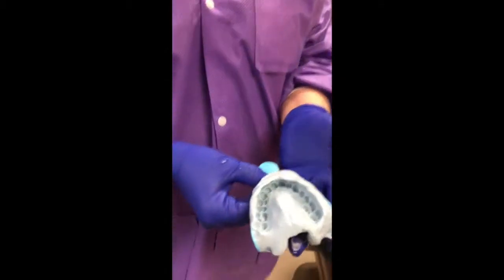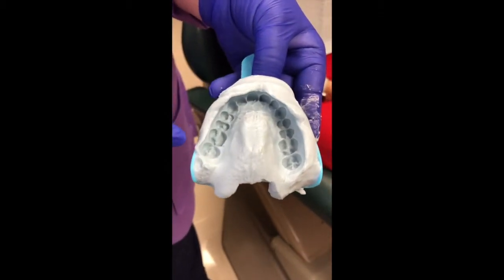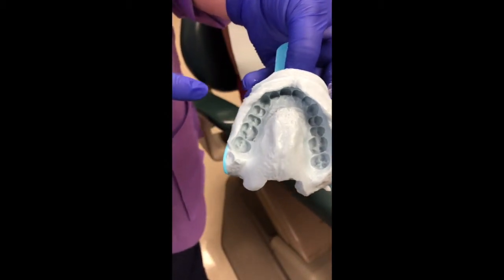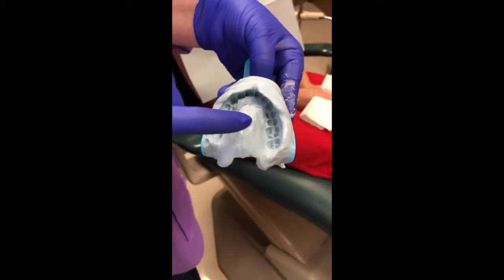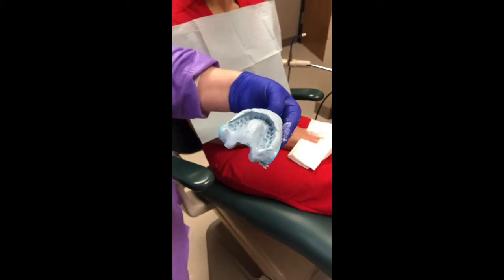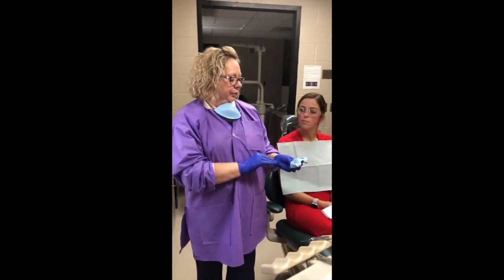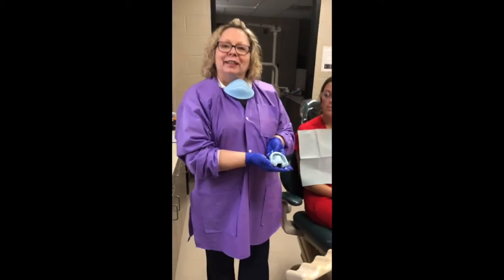And here's what the inside of the impression looks like. We have a nice amount of tissue all the way above, so that if we were using this to make a whitening tray, we would be able to get it up nice and high over the very front of all of her anterior teeth, or all of her teeth for that matter. So there we go. That's it. That's how you make an impression.